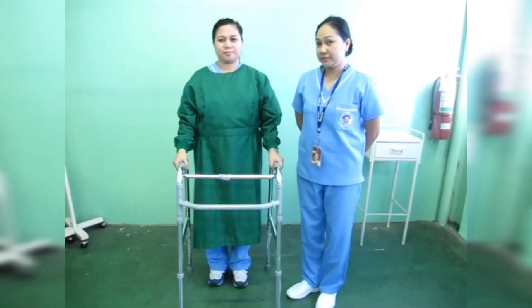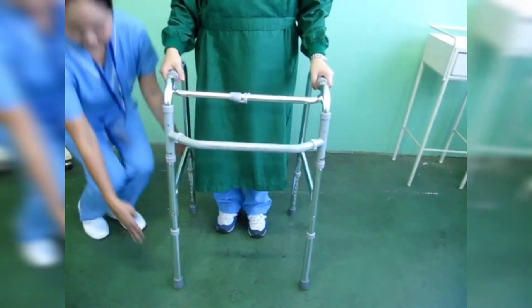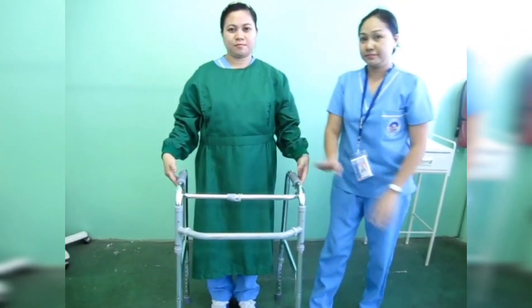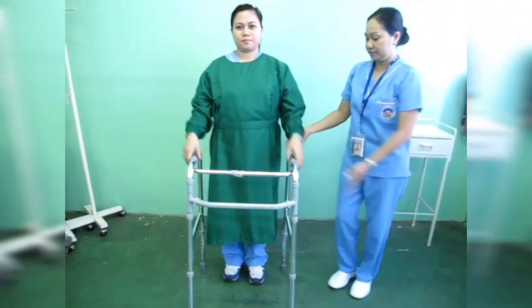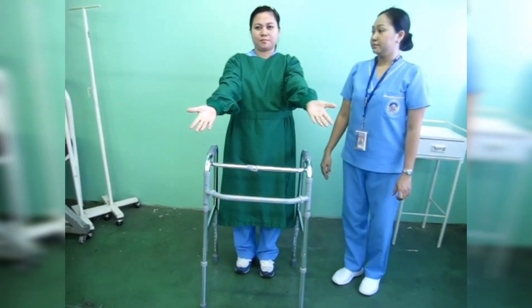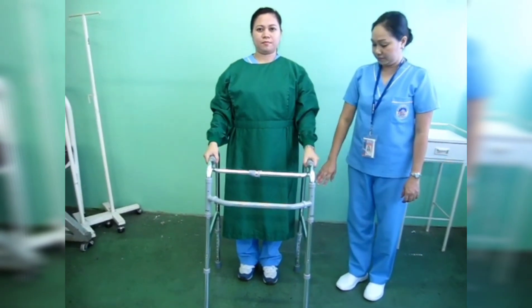The standard type is made of polished aluminum. It has four legs with rubber tips and plastic hand grips. The standard walker needs to be picked up to be used. The client therefore requires partial strength in both hands and wrists, strong elbow extensors such as the triceps brachii, and strong shoulder depressors such as the pectoralis minor. The client also needs the ability to bear at least partial weight on both legs.